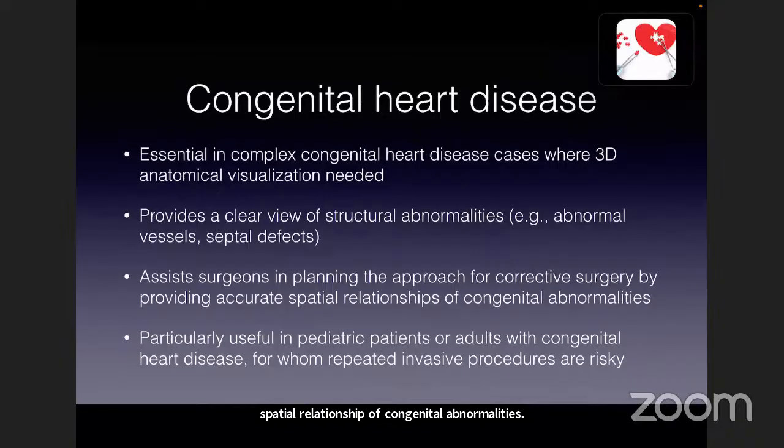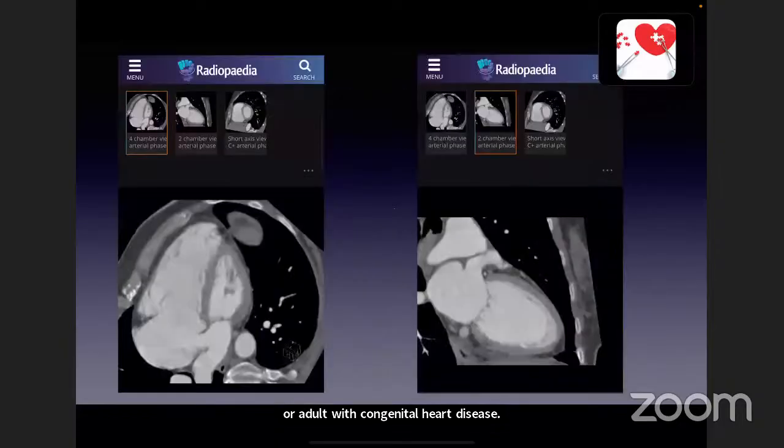It is particularly useful in pediatric patients or adults with congenital heart disease for whom repeated invasive procedures are risky. Okay, here are two pictures showing us the ASD.